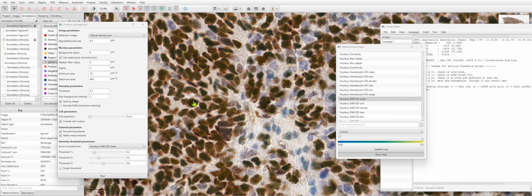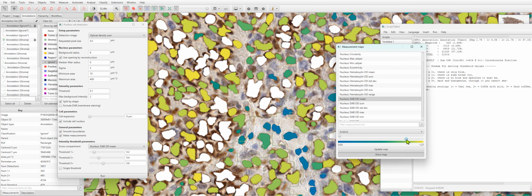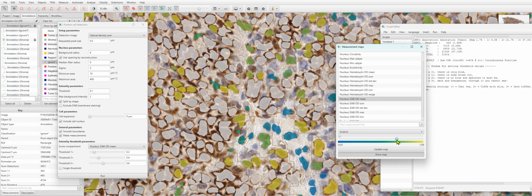So let's pick this nucleus right here, and let's back this off until that pops out of existence. Then let's look again at another one that's still 3+, because remember, 1+, 2+, and 3+ are ranges. They're not specific points. So that's probably better.